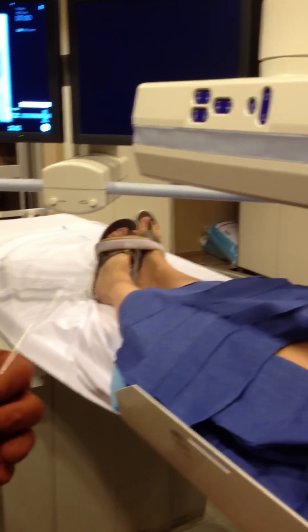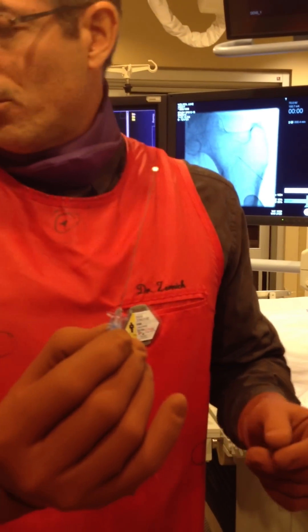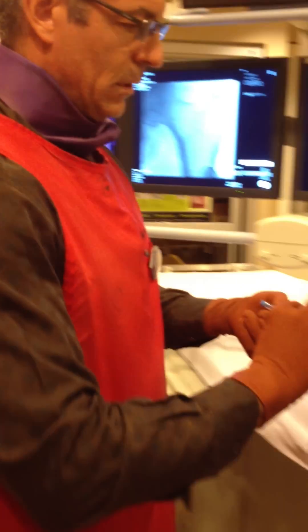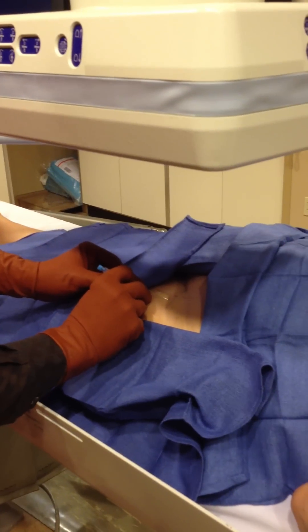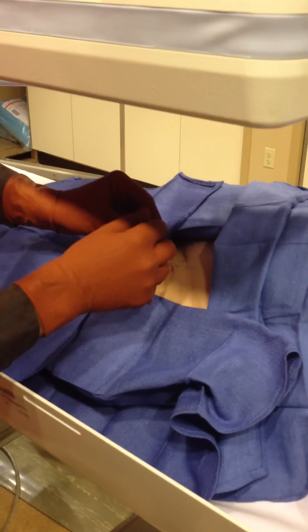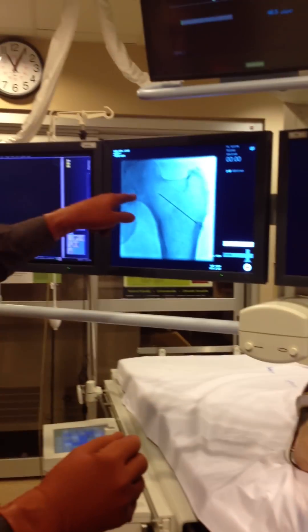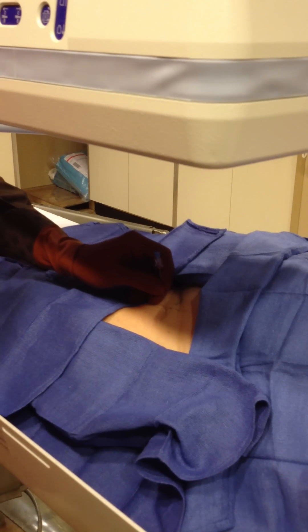Then we use a regular 21-gauge spinal needle. The tray we open is the same tray we open when we do lumbar punctures. Back to the same spot. I don't usually fluoro as I'm doing this, only to check my needle position. Right there — that's going to be too steep. So let me check my fluoro position.